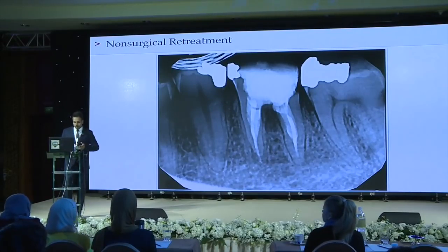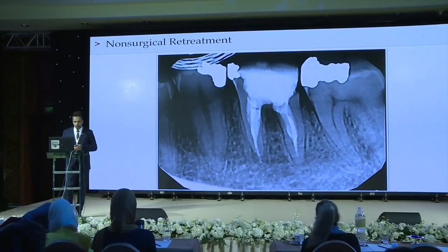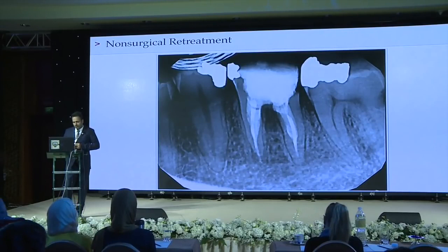And the problem with this root canal treatment is that it was extensively opened coronally with very small sizes apically. And that's funny because we always aim for less taper and big sizes compared to this case. And these are compromised cases where you hope for the best and you prepare for the worst.